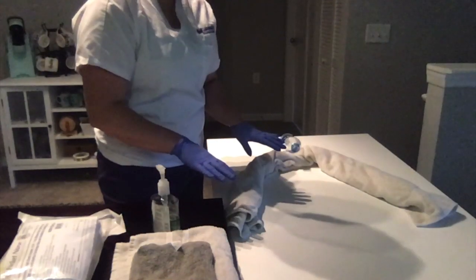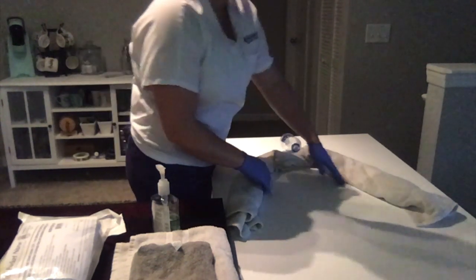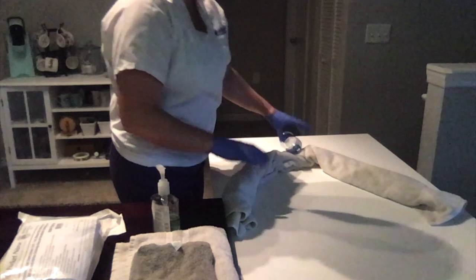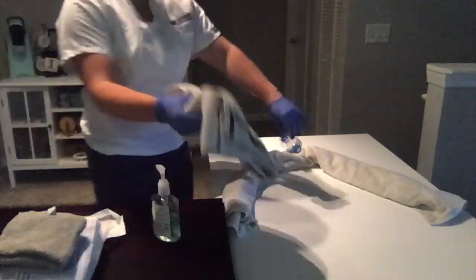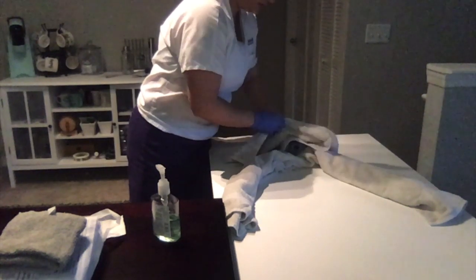So once my table is at a working height, I'm going to assist the patient into a supine position with her legs slightly spread and her knees slightly bent. Then I'm going to go ahead and expose by lifting it up, but I'm giving her a little bit more privacy by placing a drape over her stomach.